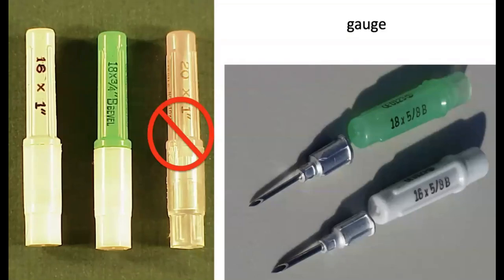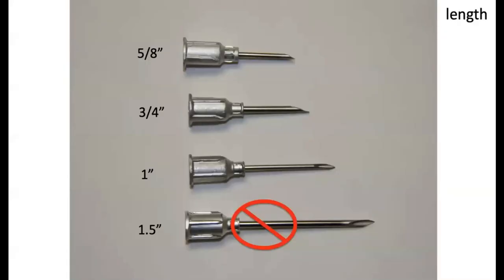The other needle gauge you see I have up there in the left-hand picture is a 20 gauge needle. And I'm going to tell you that's going to be one from an injection standpoint we really probably want to avoid in most situations. With those 20 gauge needles, it's just too easy to bend those needles. They bend much easier than a 16 or 18 gauge needle. So in most situations, that's not going to be a needle gauge I'm going to be looking at for giving injections. We're going to really focus on those 16 or 18 gauge needles.